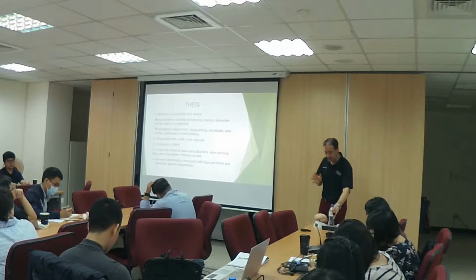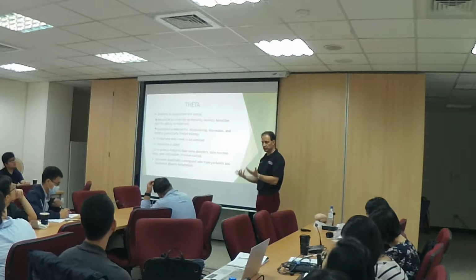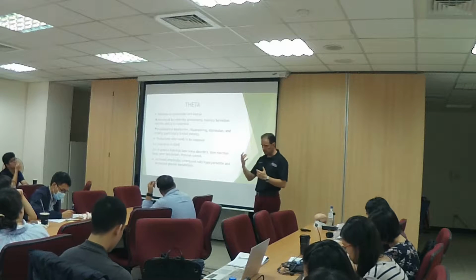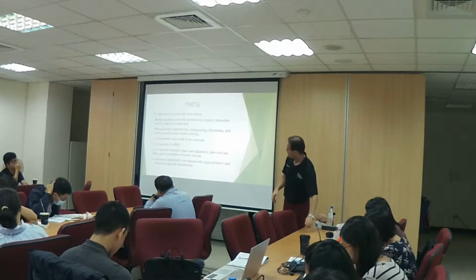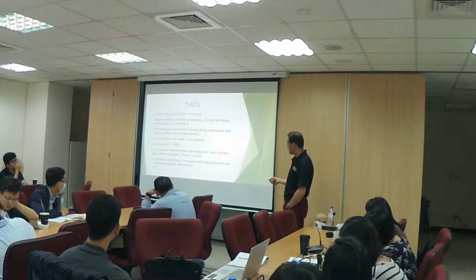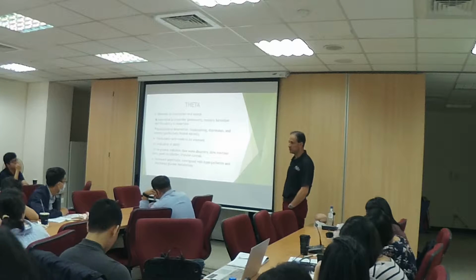So as you can start seeing, most brainwaves are involved in most conditions, one way or the other. So the important thing is where in the brain and what the activity looks like. We look at the theta beta ratio. If it is more than 3 to 1, it's indicative of ADHD.